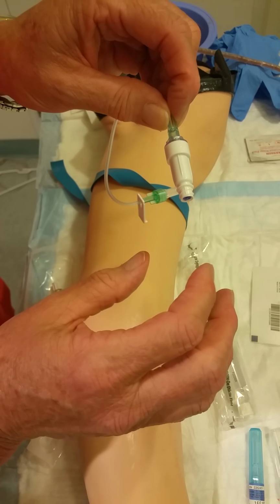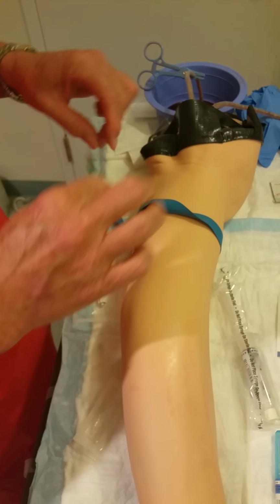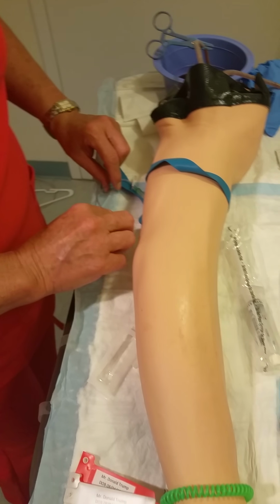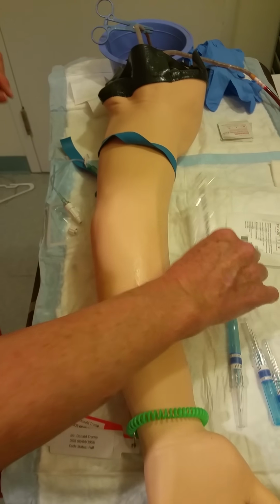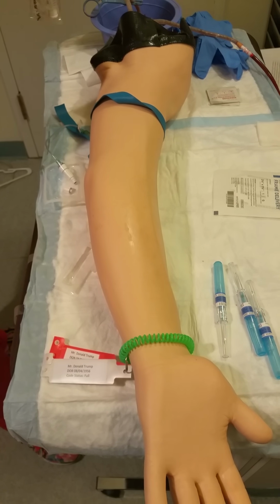Finger tight will be adequate for this. You don't have to attach it so tight. Maintaining the aseptic condition of the injection valve, I will attach my saline flush.